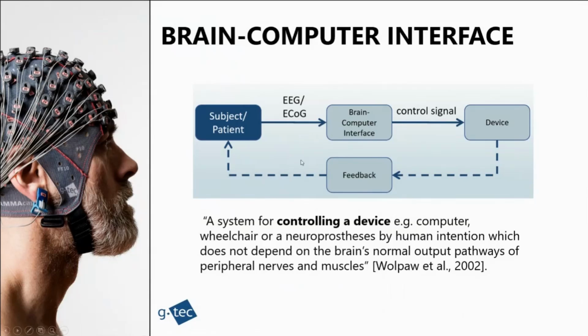the command in control. One particular example I will list out today would be the recoveriX for a stroke patient. So there will be two stimulation boxes attached to the patient's left and right hand as the device.